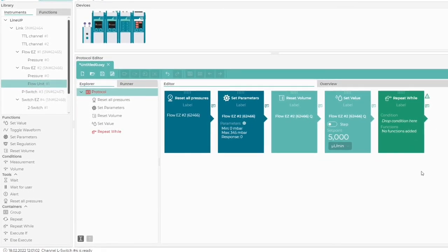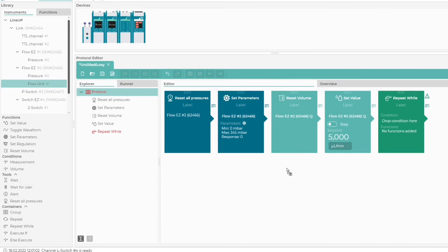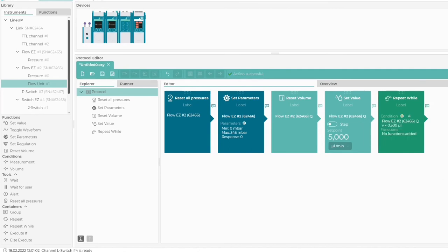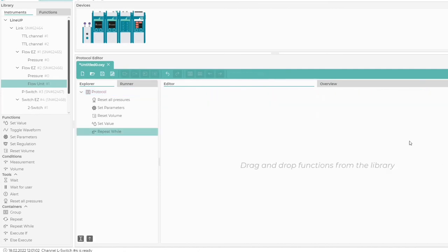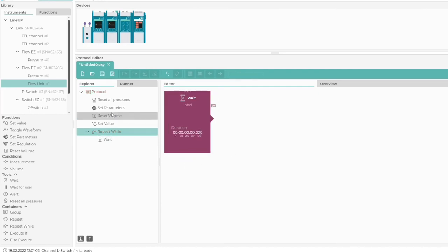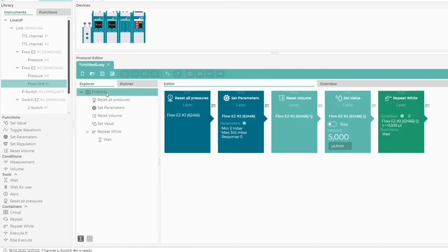Now we can finally add Repeat While. Let's add our condition. Let's add our condition block with a set time of 20 milliseconds. This means that the condition will be checked every 20 milliseconds until it is evaluated as true.